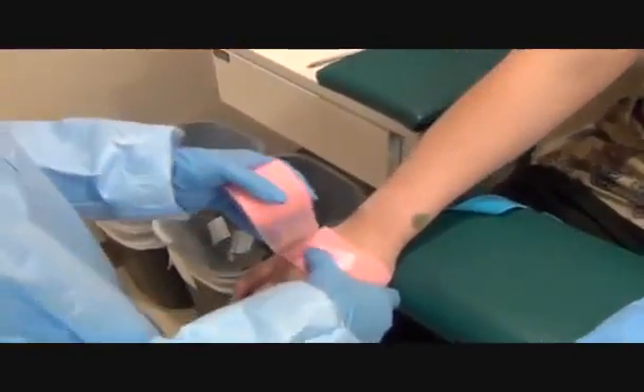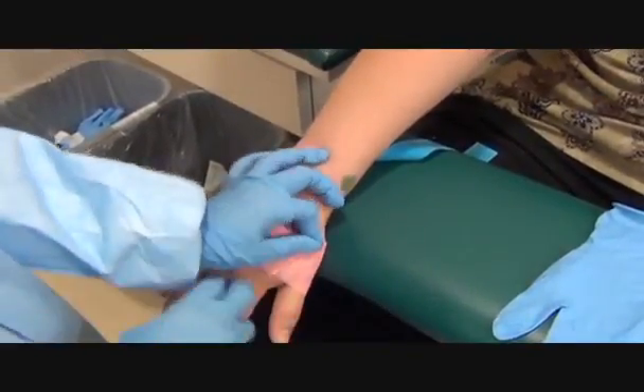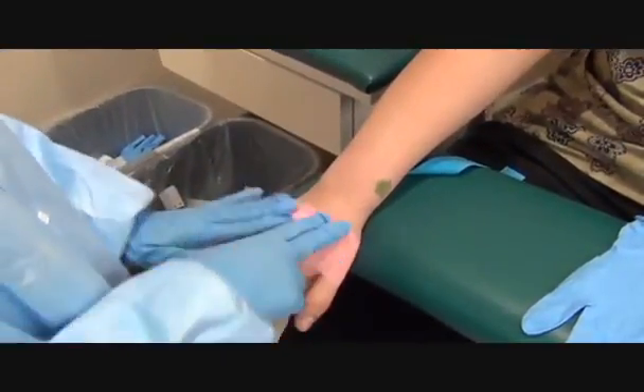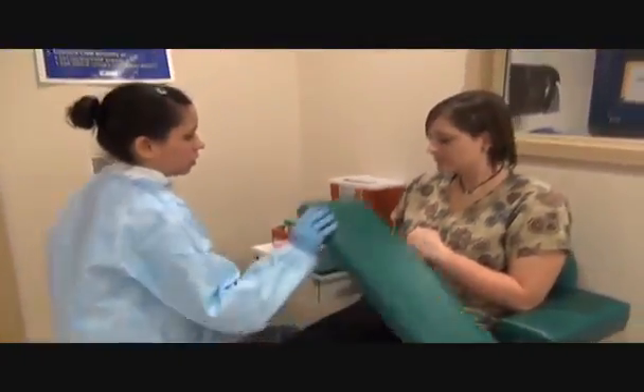You want to make sure that you put it tight but not so tight you're cutting off their circulation. Tear it and then just rub it to itself and it will self-adhere. Okay, are you feeling okay? Yes. Okay, you're all done. Thank you.